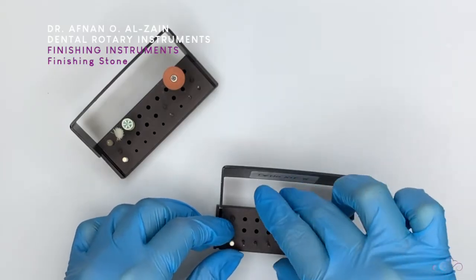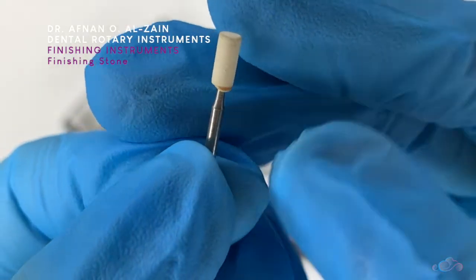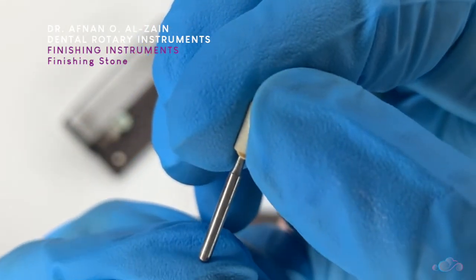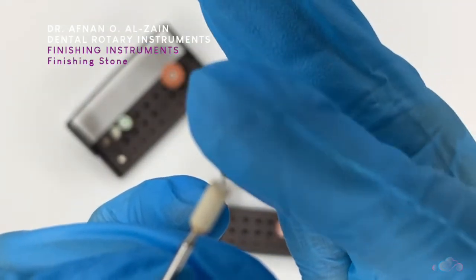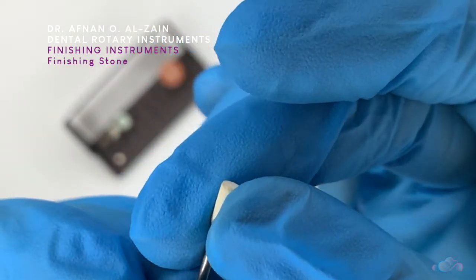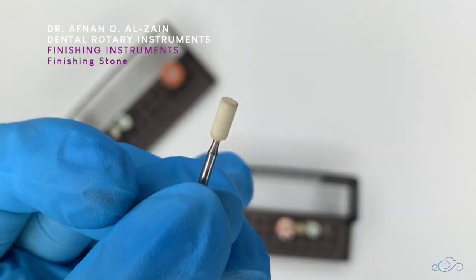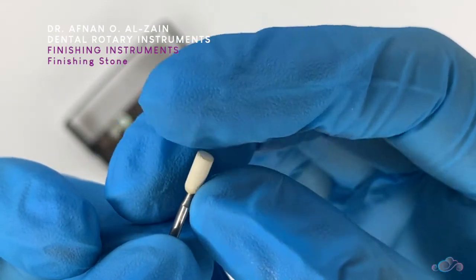Lastly, we have the finishing stone. This is made from mountain stone and it is very aggressive. It comes in high speed, but we don't use it anymore. I just put it here for you to see and know what it is, but we do not recommend using it because it will abrade a lot from the tooth structure and from the restoration. It is very aggressive — we no longer use it.